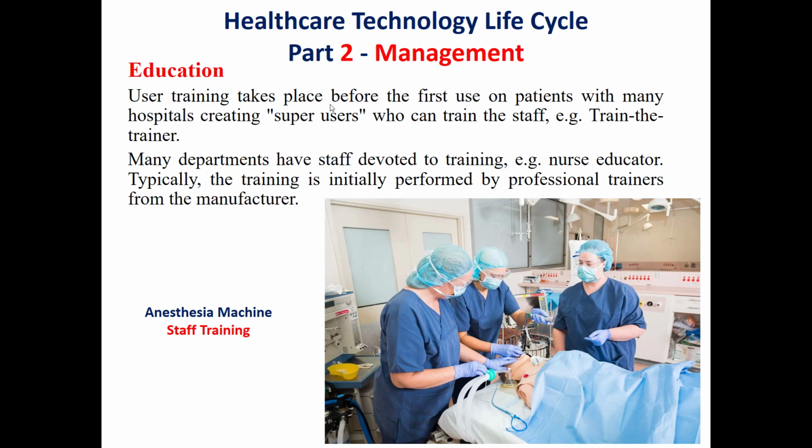After the deployment phase, the second part or the first phase in the management part will be the education. The education, as we said before, should be done for 2 types or 2 categories. The first type or group will be for the users. The second part will be for the clinical engineering staff. For the user training, the training should take place before the first use on patients. This is because of safety, to ensure that the use of this device will be safe after appropriate training has been given to the users.